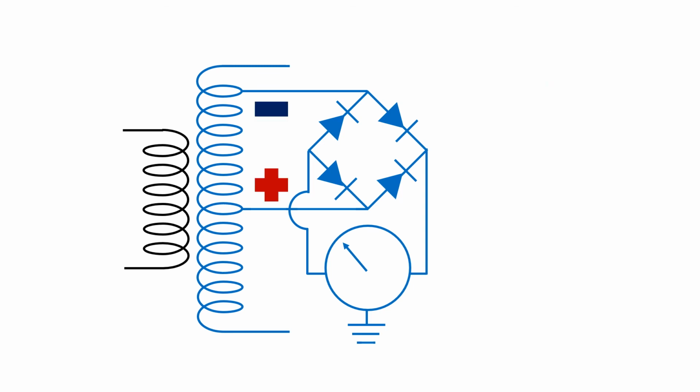The MA meter tells us what MA we're actually using. Follow along as the electrons travel through this circuit during one half of the polarity cycle. Then let's flip the polarity, and one more time, follow as the electrons travel through this circuit.